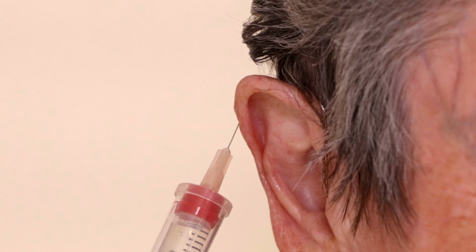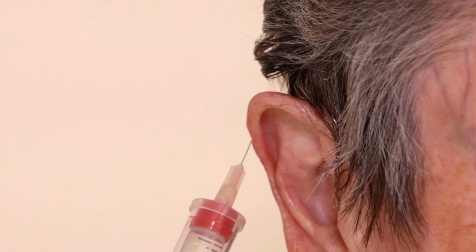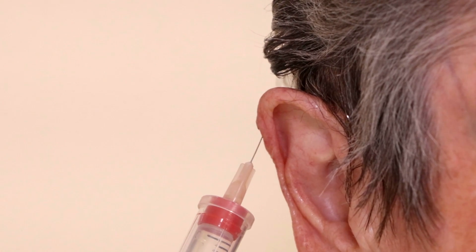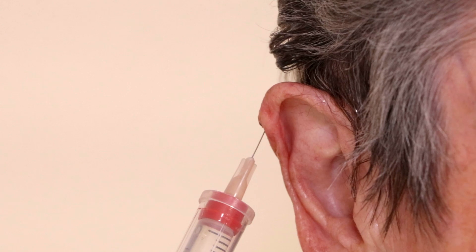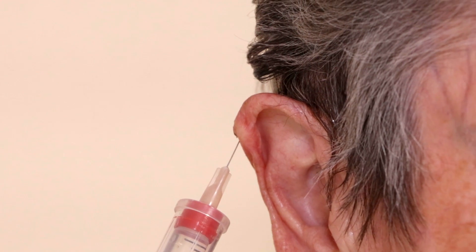I'm going to give the injection now. We are not using epinephrine in this shot because it's in the ear — that can decrease blood supply for a long time and cause problems, because you have that cartilage in the ear that doesn't have good blood supply already.